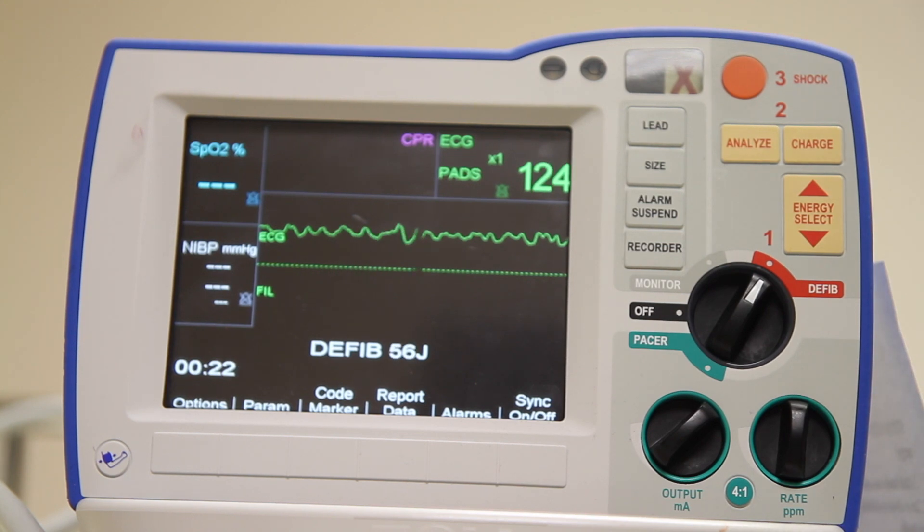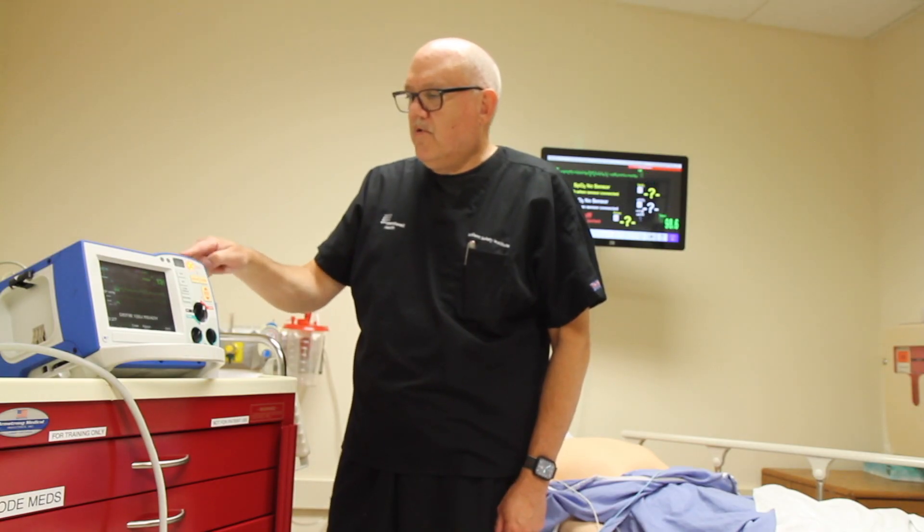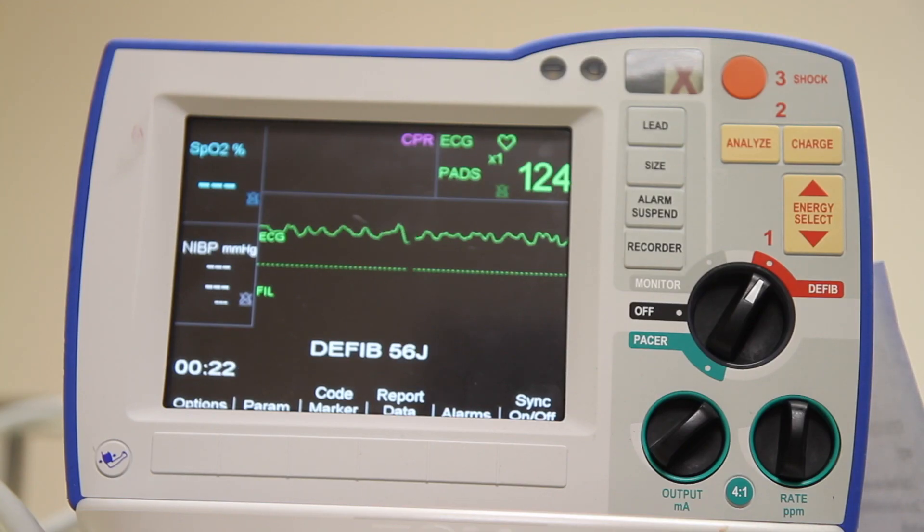When I'm ready to go, I press the charge button. When the device is charged, an audible alarm will sound and the step three shock button will light up, meaning the device is ready to be discharged.